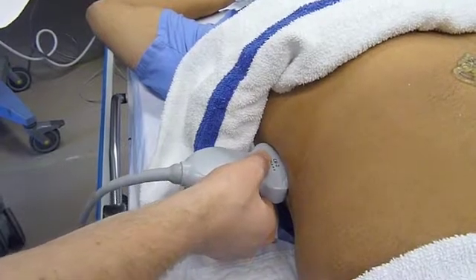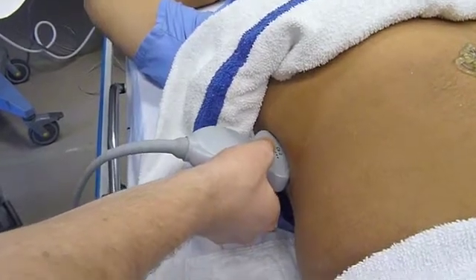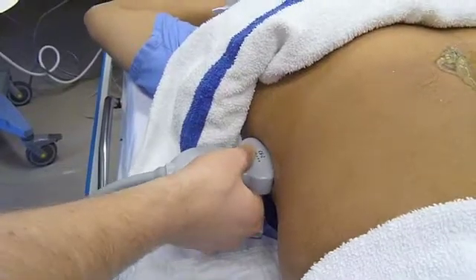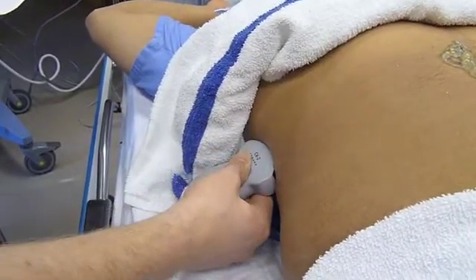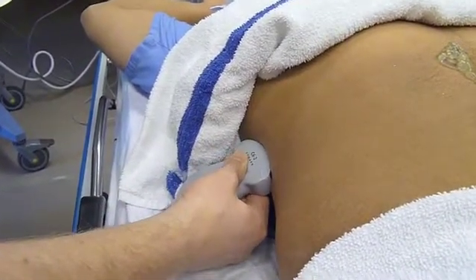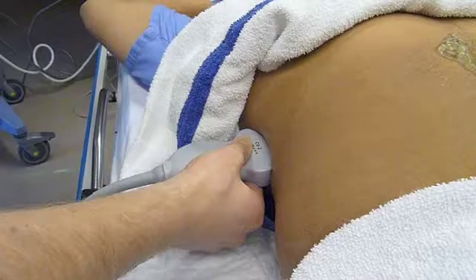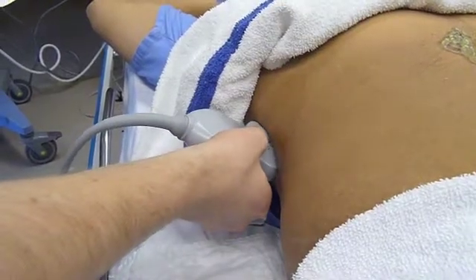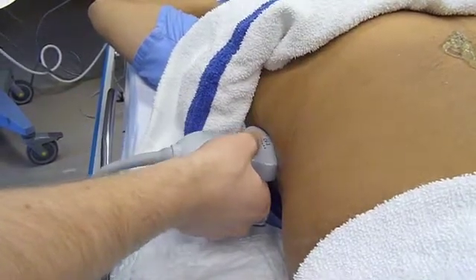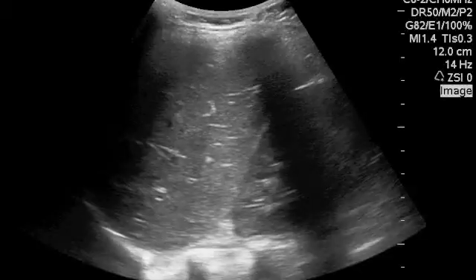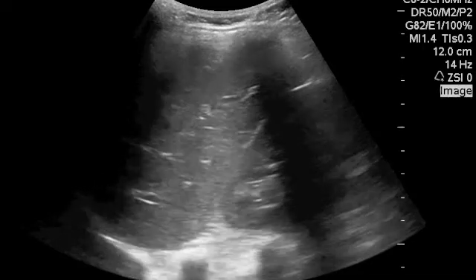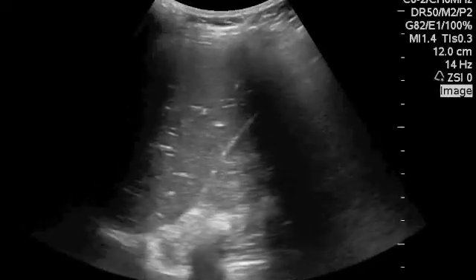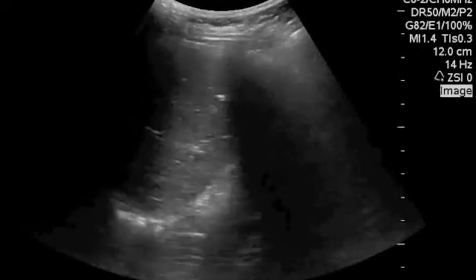Now that I've found my interface, I need to sweep. Here's what a sweep looks like: I keep my contact point constant and I tilt the probe in each direction, anteriorly and posteriorly. Before I sweep, I optimize my depth.